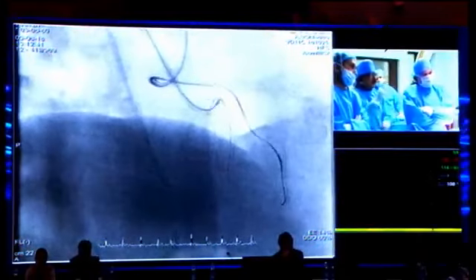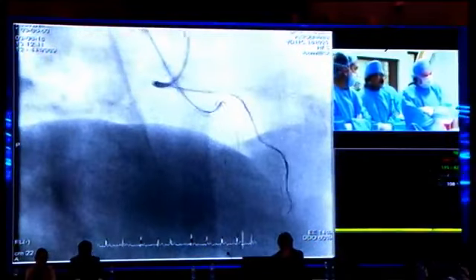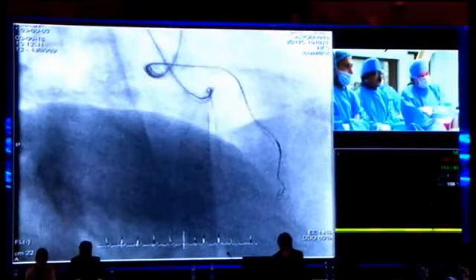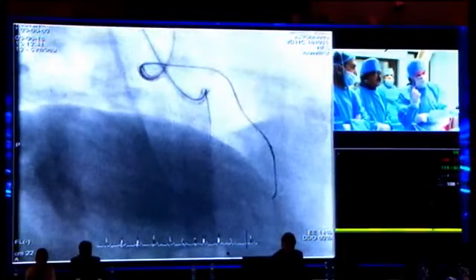You see, it had to make a Z bend, so German technology. It will move up and then come down. There it's moving up. So I work actually, as mentioned, by turning.